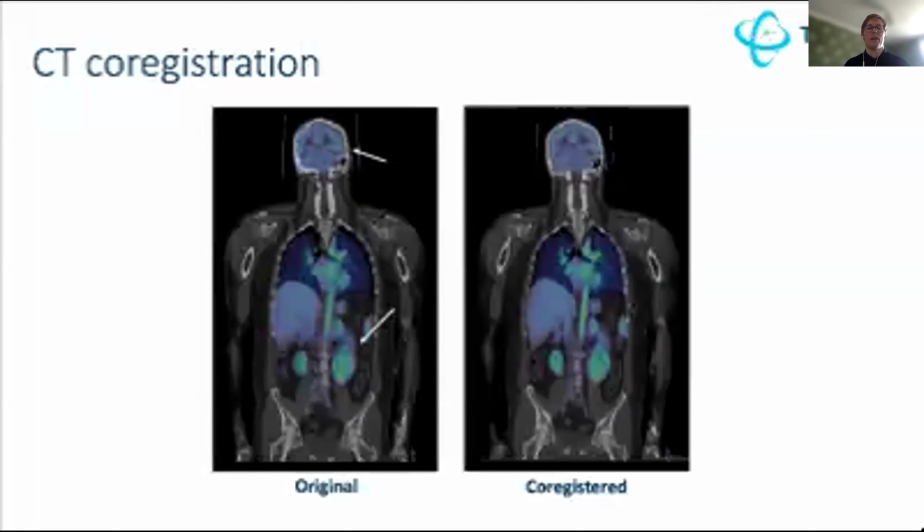And here we have chosen to align the CT image to the PET, which then ensures that the PET measurements would remain unaltered. And in order to get a good match, the CT is elastically co-registered, which also improves the alignment of the CT-based ROIs with the PET image.